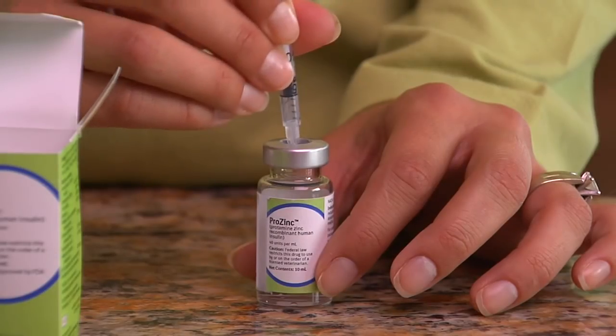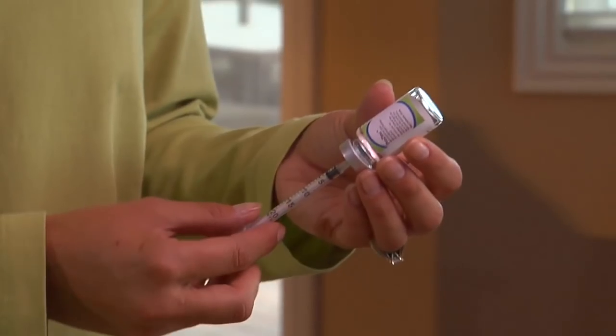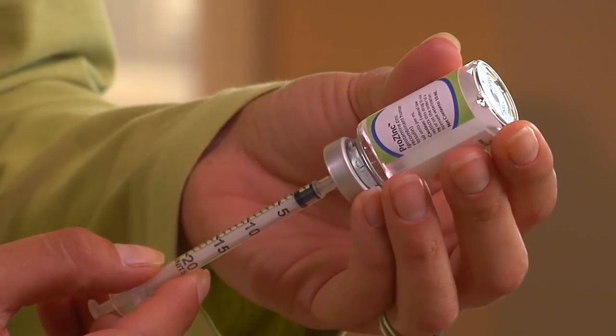Stick the needle into the top of the insulin vial and push the plunger all the way in to inject air into the vial. With the needle still inserted, turn the vial upside down. Look to make sure the tip of the needle is all the way submerged in the liquid, so you won't draw air into the syringe.